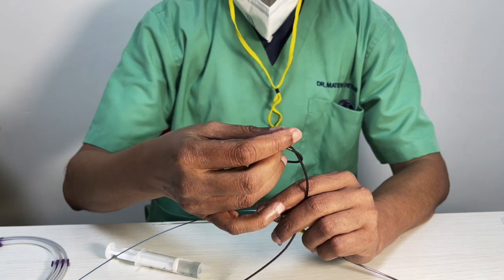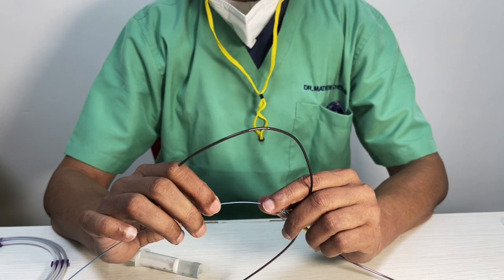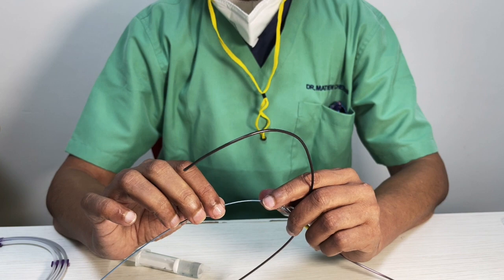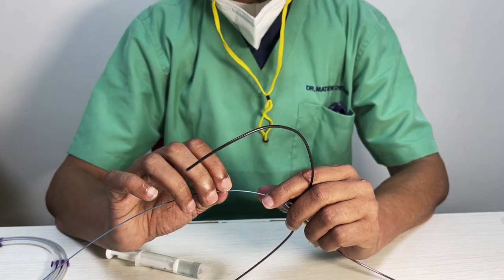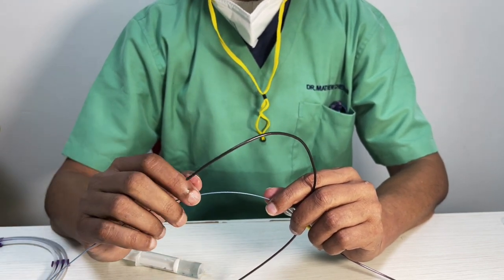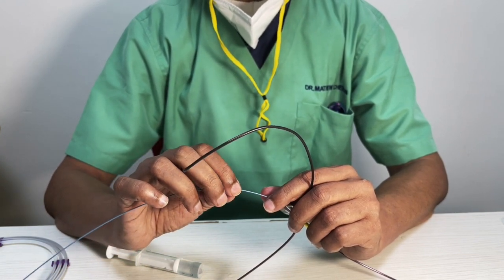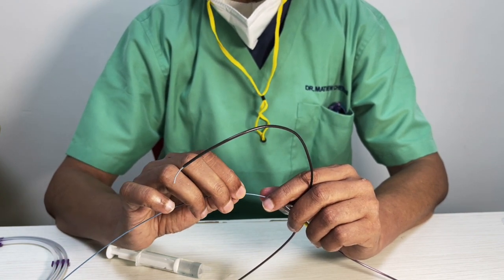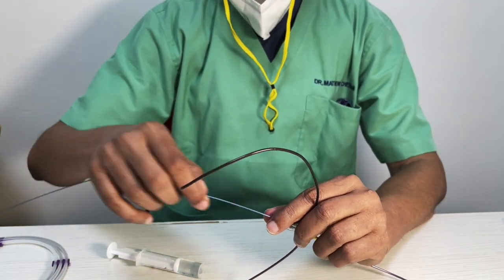And Navion was basically the first company that decided to do a braiding end to end using nitinol. So understand the problem is, you may feel that the pushability may come down, but in real practice, we find because this goes through a long sheath, pushability is not such a big issue. Now, when Penumbra created the Neuron, they actually initially thought the neuron will be used without using a long sheath, and directly we'll be taking it through a short sheath and then pushing it. But finally, we all use a long sheath, and the pushability factor is not such a big important thing.